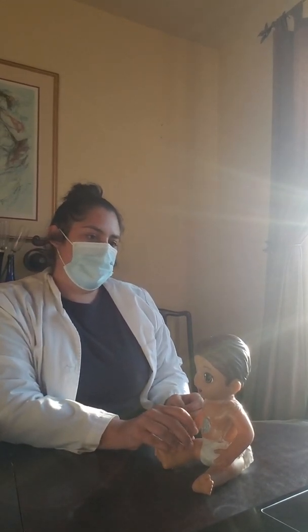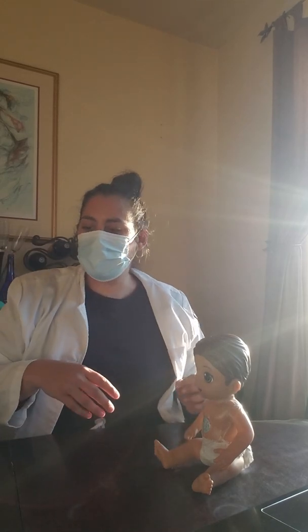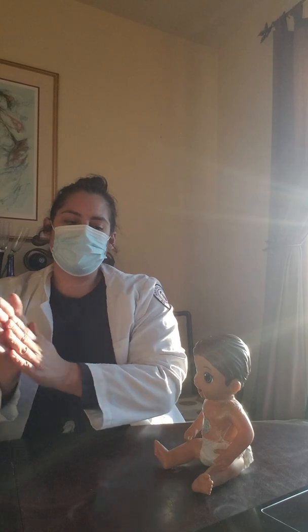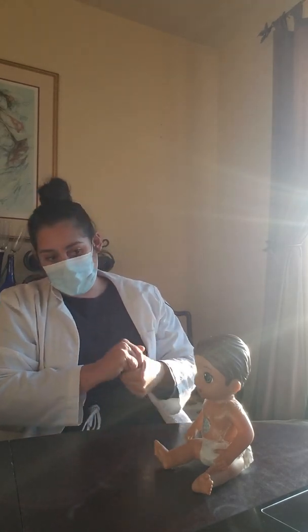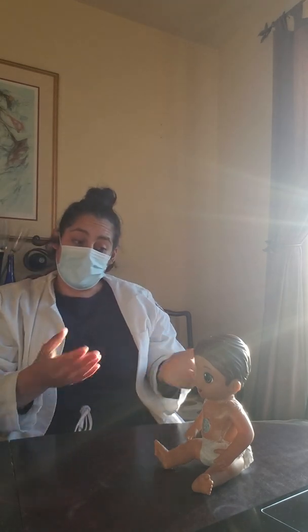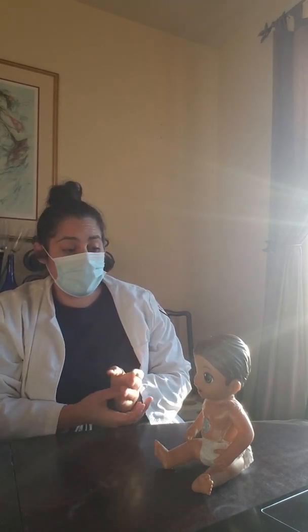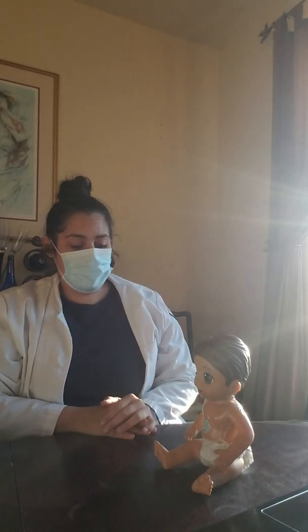Jack Tracy, 11/21/1951. You look so young for your age. Okay. So, Mr. Tracy, I'm here to do the dressing change, routine dressing change, as I said. Before we get started, I'd like to ask you, though, are you in any pain from a scale of 0 to 10? 0. Okay, great.